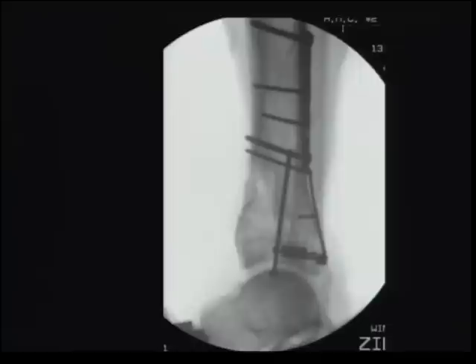So if the dorsiflexion deformity was not perfectly corrected once we did an anterior exposure, we could still change that in the future. So you can see flexible implants that are strategically placed such that they don't impede on any future anterior exposures. And that's just a small 2 millimeter plate placed in the back that reconstructs that posterior pillar. And then 2 weeks later, come back and do an anterior exposure. And then this is this patient at about a year after this injury.